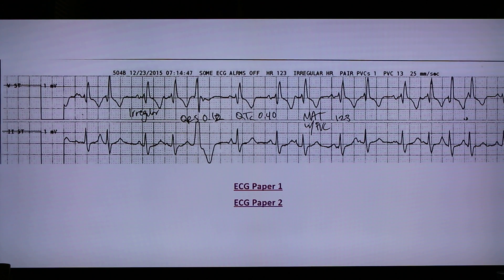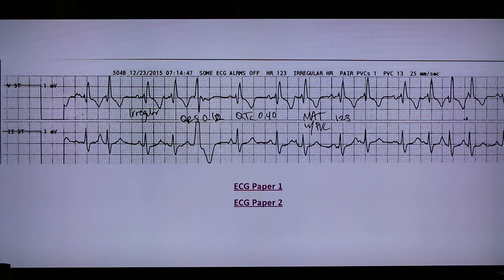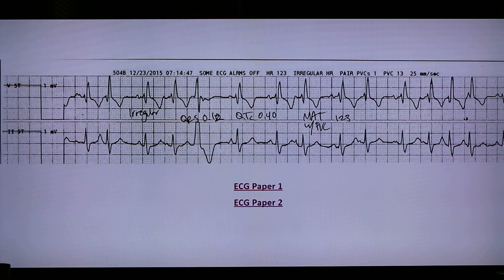This is an EKG paper of another telemetry system. Other systems will also show almost the same data like the patient's name, room number, date and time, alarms, heart rate, PVC counts, and paper speed. The default or usual paper speed used is 25 mm per second.